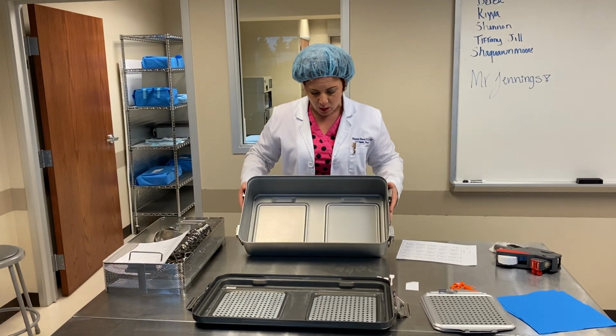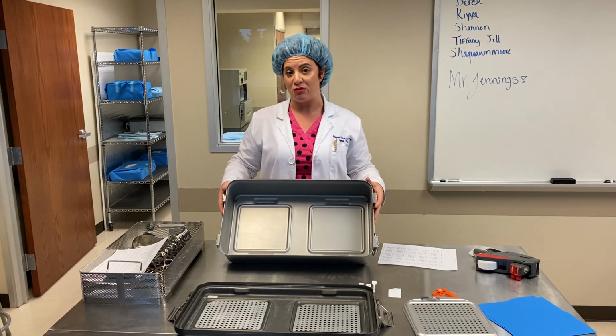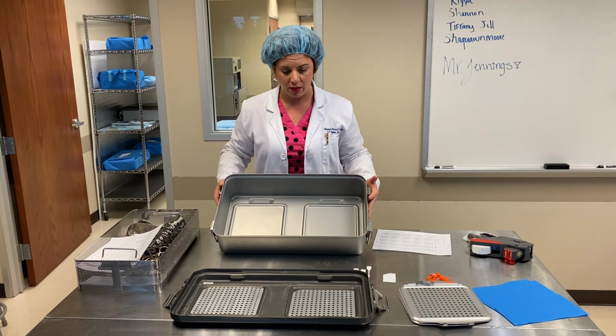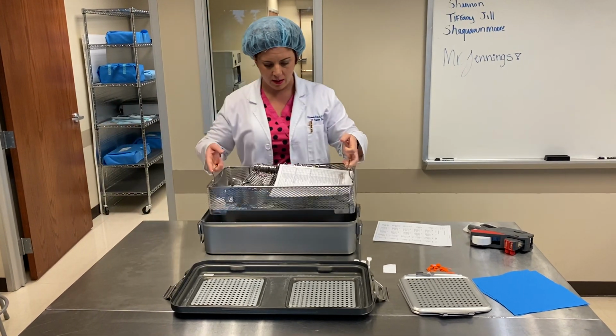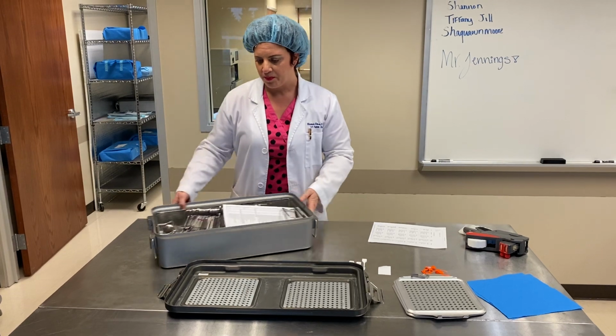One of the first things we want to do is look inside here and make sure that it's clean and dry. This one doesn't look so clean, but it does look dry. However, we would make sure that it's clean and dry. Then we're going to set this pan of instruments that we've already prepared in there.